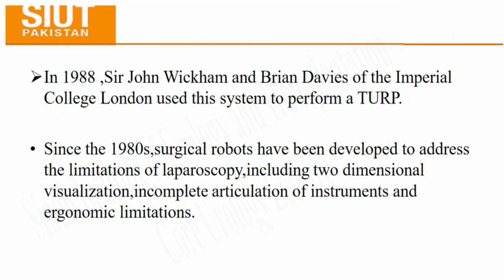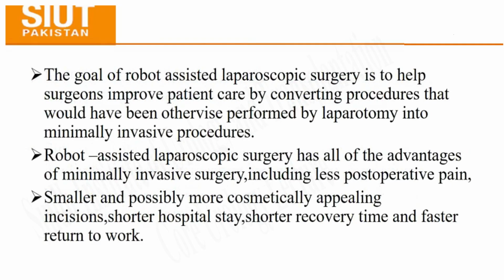Since the 1980s, surgical robots have been developed to address the limitation of laparoscopy, including two-dimensional visualization, incomplete articulation of instrument, and ergonomic limitations. The goal of robot-assisted laparoscopic surgery is to help surgeons improve patient care by converting procedures that would have been otherwise performed by laparotomy into minimally invasive procedures. Robot-assisted laparoscopic surgery has all of the advantages of minimally invasive surgery, including less post-operative pain, smaller and possibly more cosmetic appealing incisions, shorter hospital stay and shorter recovery time, and faster return to work.